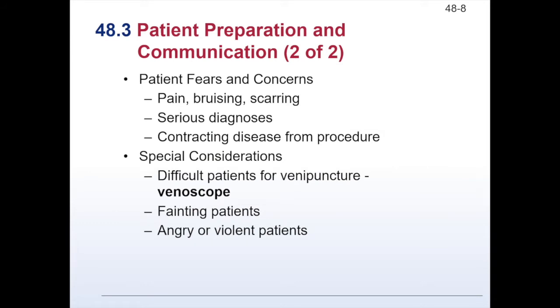Patient preparation and communication. Patient fears and concerns. Patients are often fearful of needles and the process to draw blood. Be honest when asked about the pain factor. It may be helpful to have the patient focus their attention on something other than the procedure or to close their eyes during the poke. Tell the patient to inform you if they feel lightheaded or faint.